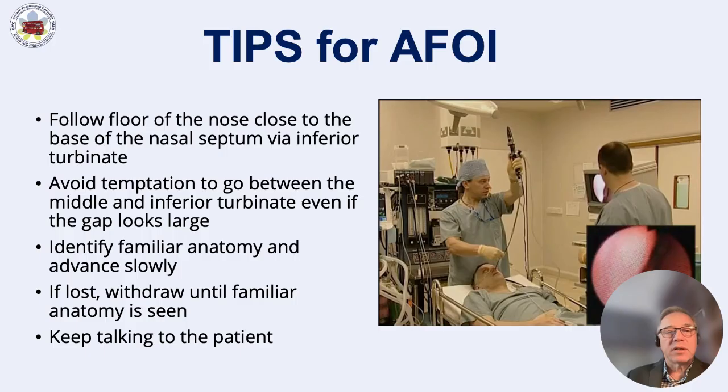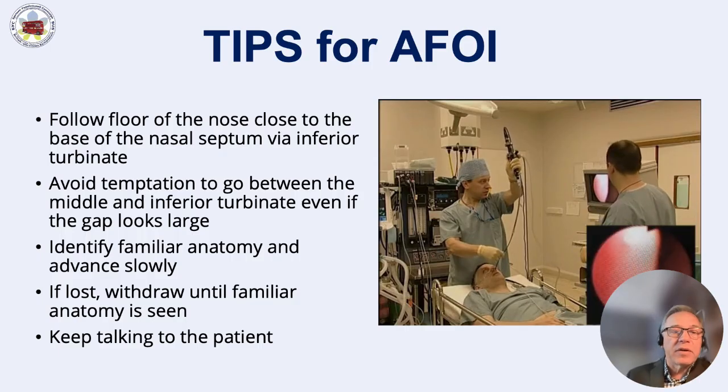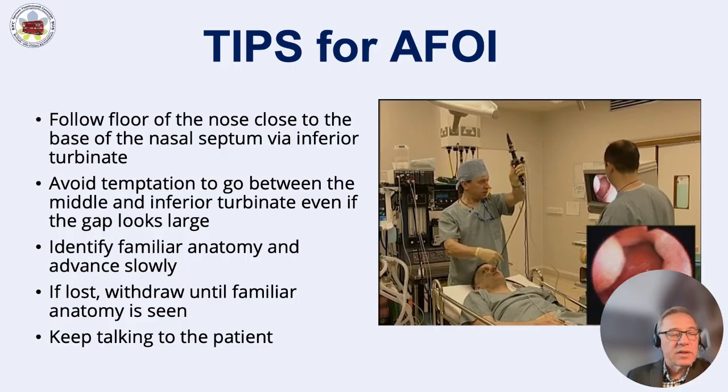There are a few tips I would like to tell you about awake fiber optic intubation. You follow the floor of the nose close to the base of the nasal septum. Avoid the temptation to go between the middle and inferior turbinate, even if the gap looks large. Identify the familiar anatomy and advance quite slowly. It's pretty uncomfortable for the patient if you rush through. Sometimes there is a mentality that the quicker I do it, the easier it is for the patient. It's not.